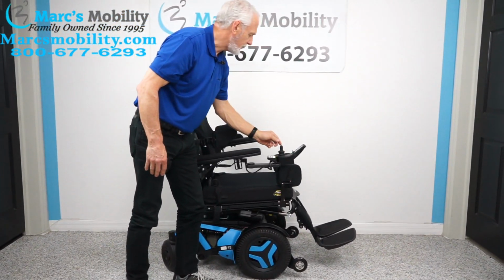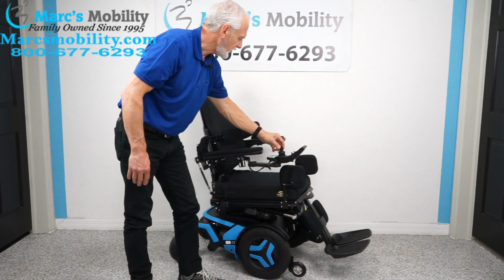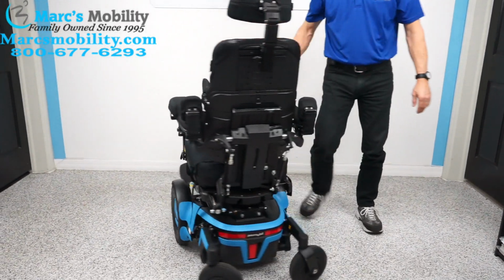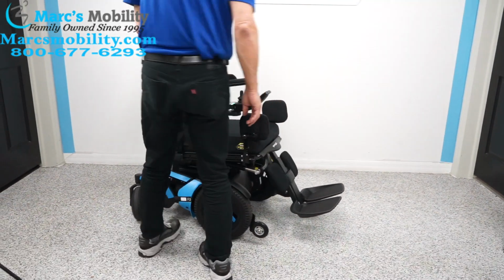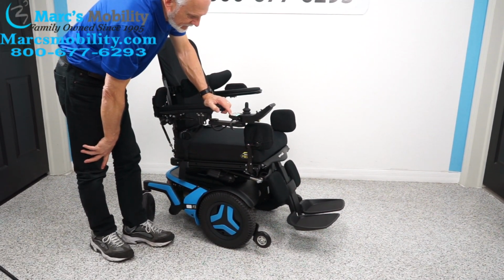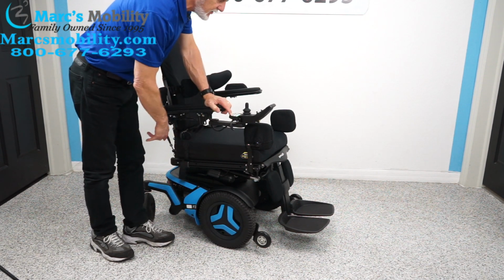We're going to turn the power back on. Give it a second to set up, and we're going to turn the chair in a circle. So this is what your chair looks like in the house. Of course, if you were in the house, you would bring the legs all the way in, like this. So you have the best turning radius in your house, okay?